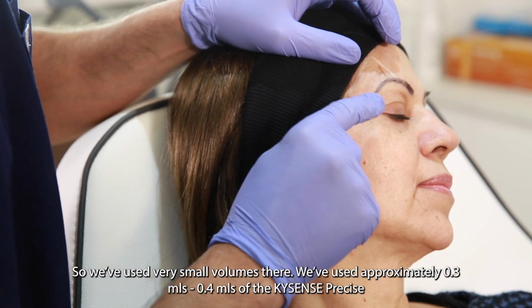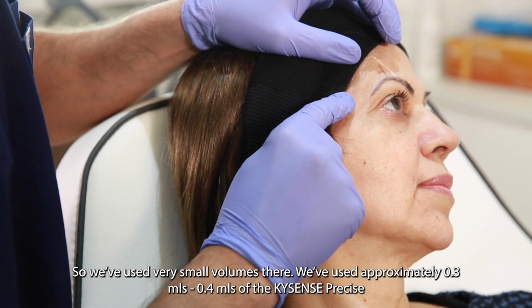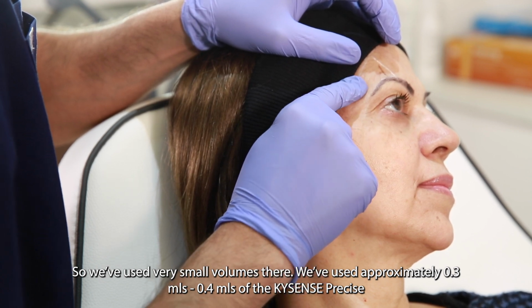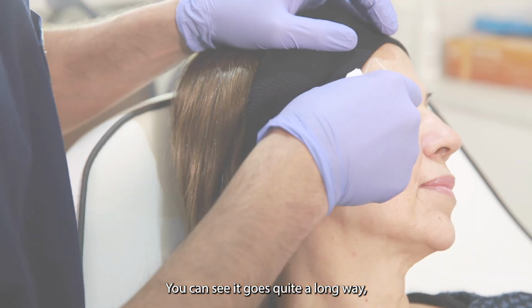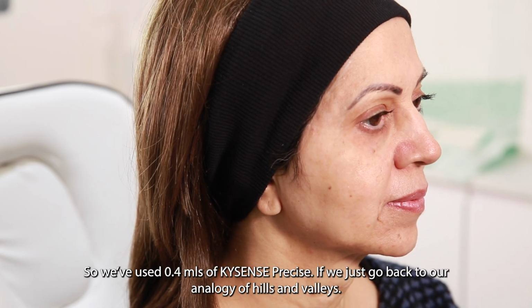So we've used very small volumes there. We've used approximately 0.3 to 0.4 mils of the KYSENSE Precise. So you can see it goes quite a long way. So we've used 0.4 mils of KYSENSE Precise.